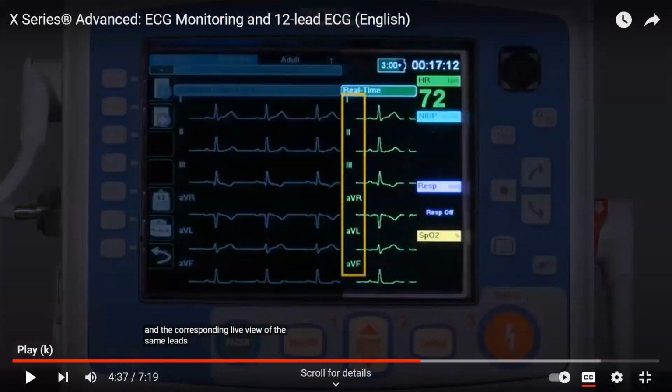So I have modified literature about the Zoll. The reason why I like this part is the direct comparison: there are actual real-time changes from a previous 12 lead to what's currently going on. Being able to go back to see if the changes are occurring in front of you is the reason why I like that dual screen.